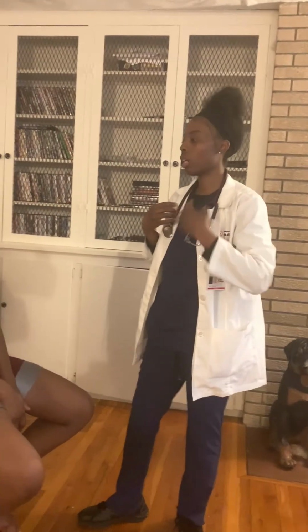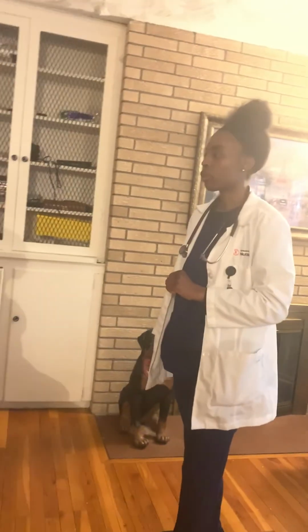All right, so S1 and S2 noted were normal rhythm, strong. There were no bruits noted, no murmurs or extra heart sounds. And as the patient noted earlier, she has not experienced any cardiac issues in herself or family members, which is good. All right, the next thing I'm going to do is go to the posterior chest wall.